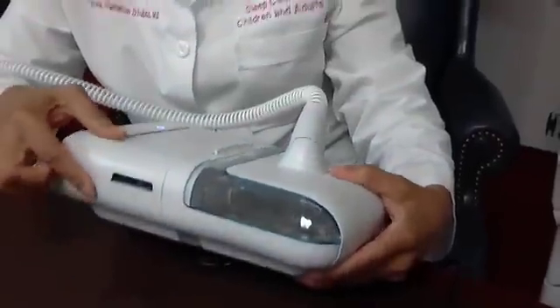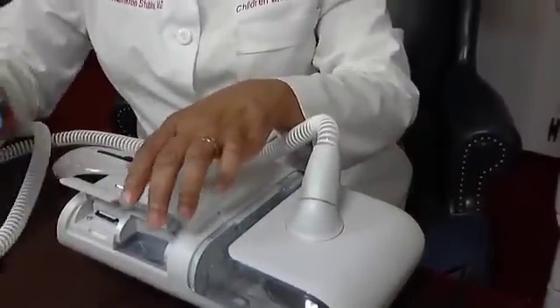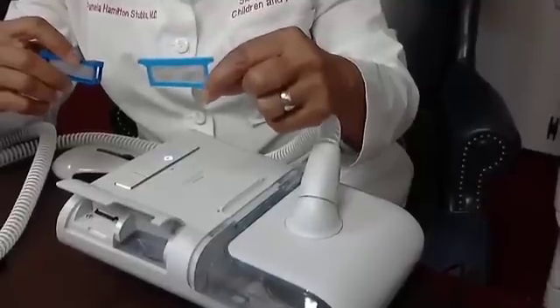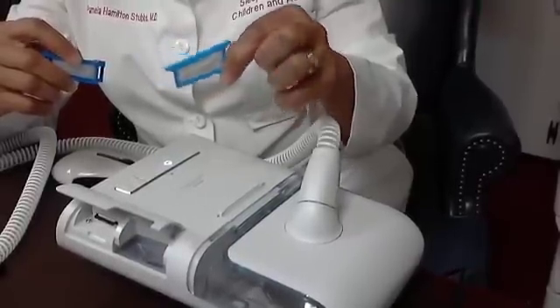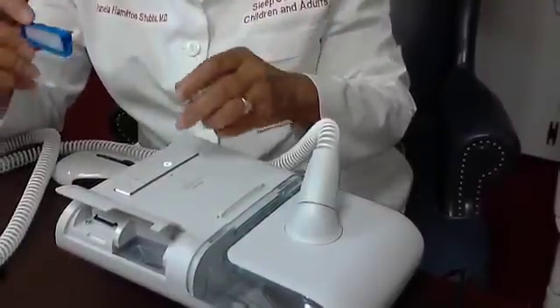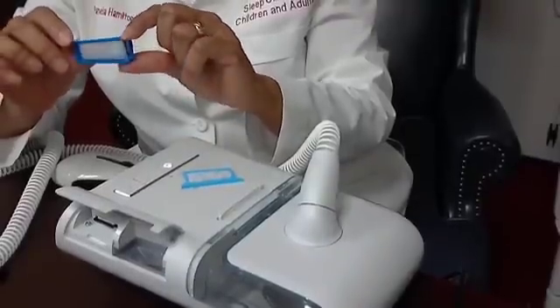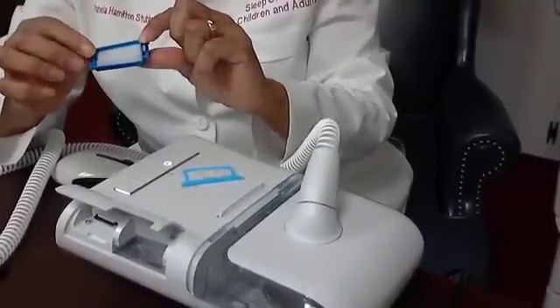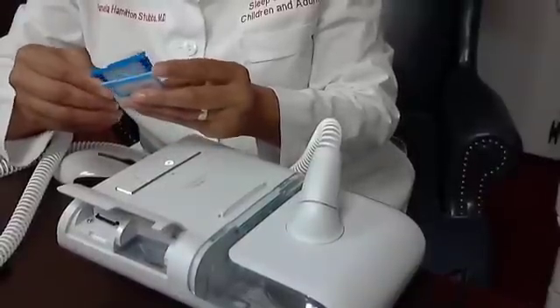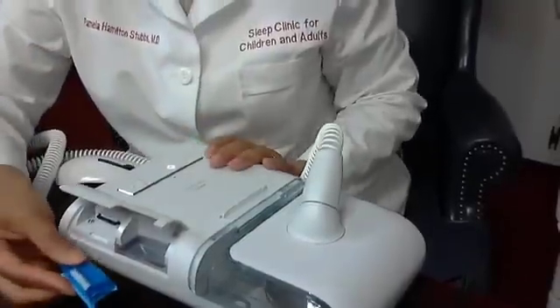The other part I want to show you is where your filters go. This is the disposable filter — it gets a gray color when it's dark and ready to be replaced. And this is the reusable filter. This white part will get dark and you just pop it out, wash it, put the pieces back together, and place it back into the unit. It fits right here.